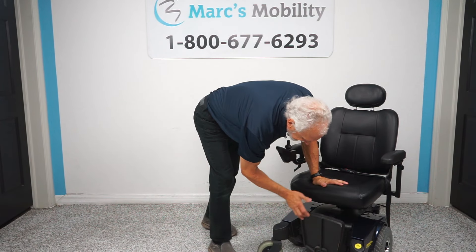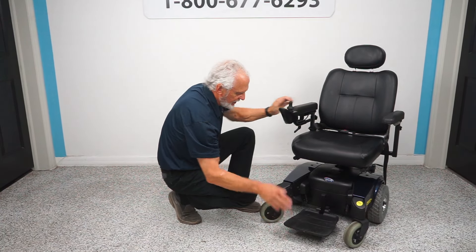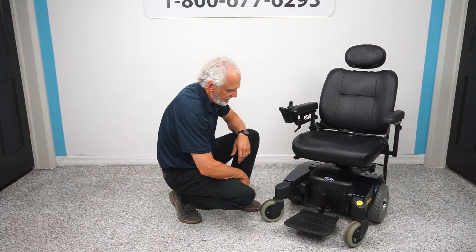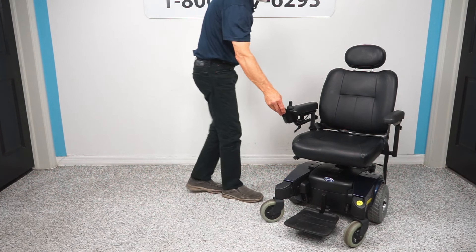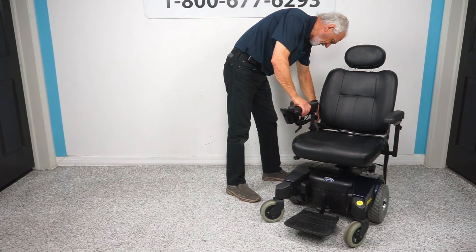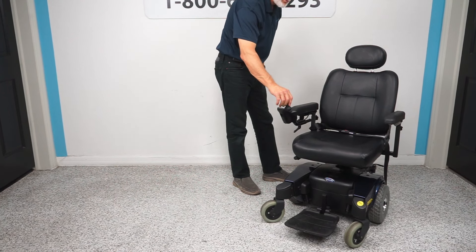The foot plate does flip up when you exit the chair and it can go out forward a little bit. I'm going to have to replace the knob on here, so we'll replace the knob and you'll have a brand new knob.